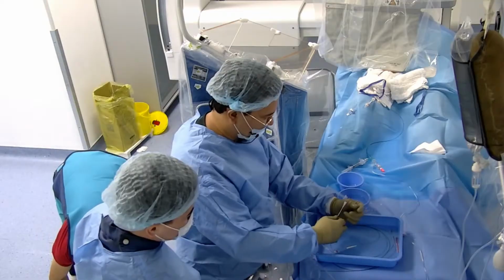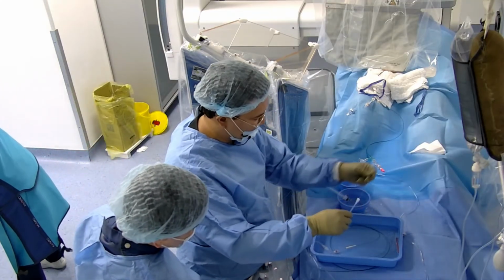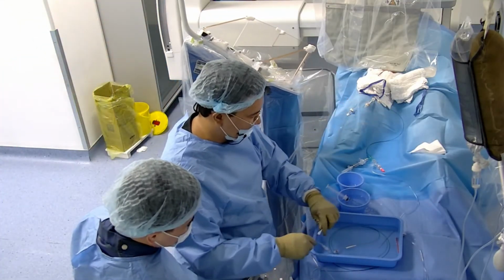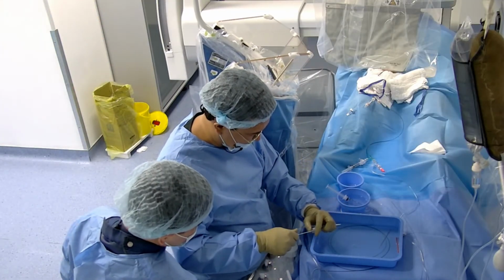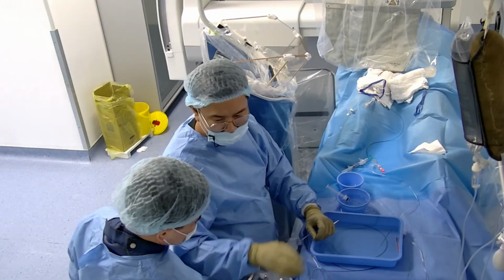Yes, I hope it will work. We will avoid the anticoagulation. Patient hyperreactive for the ticagrelor, but we should leave the ticagrelor because of the stent in place.